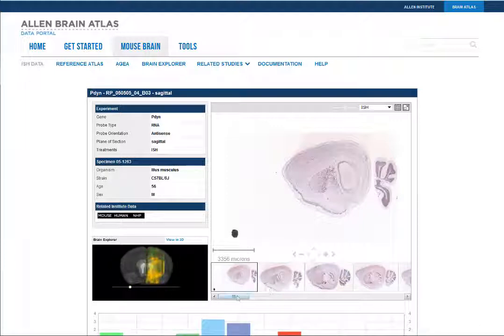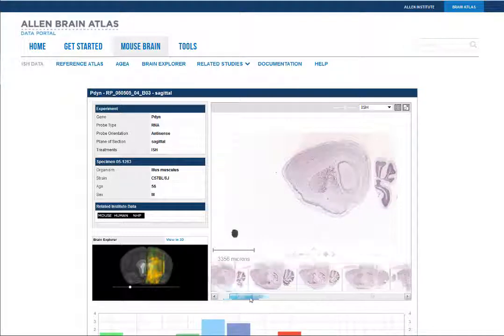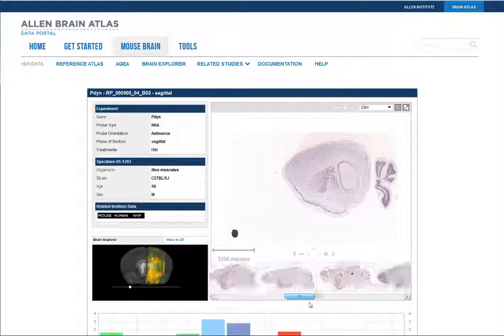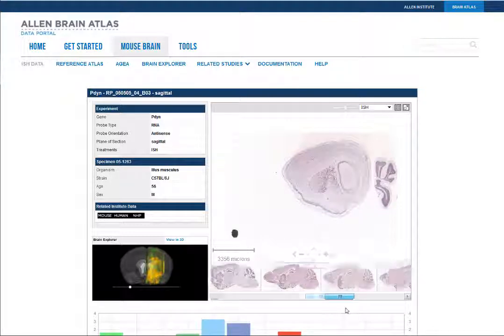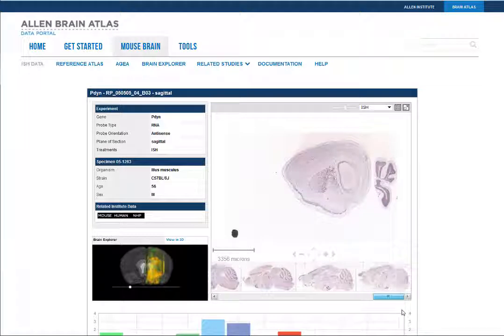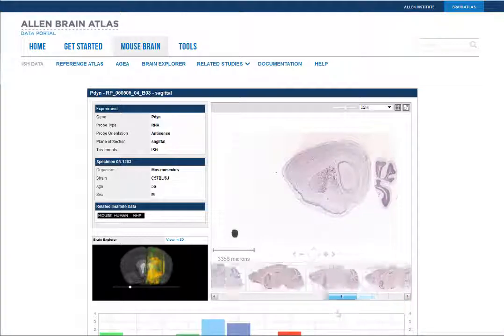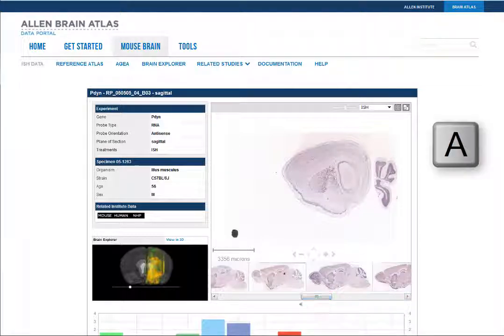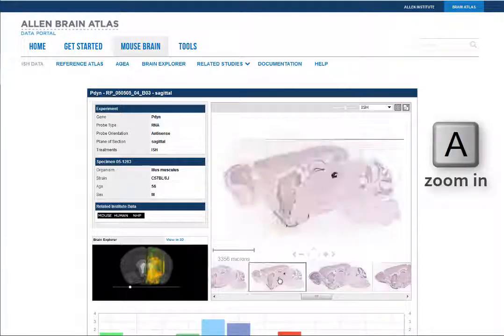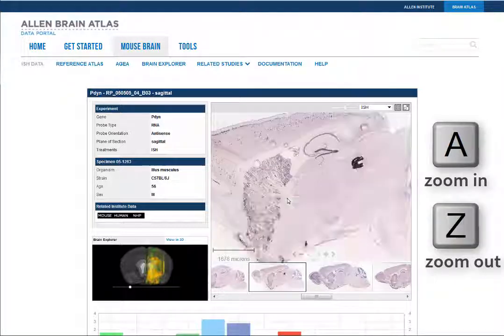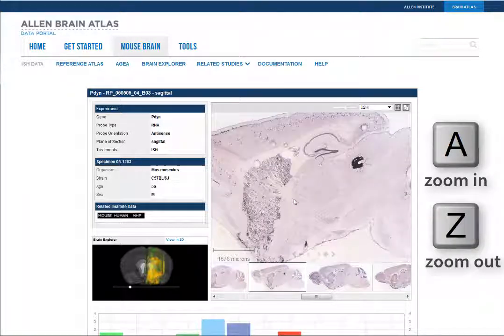Each thumbnail from the image series is along the bottom of the image viewer. Clicking a thumbnail will open that section in the main viewer. Use the on-screen navigation or the shortcut keys to zoom and pan through the images.